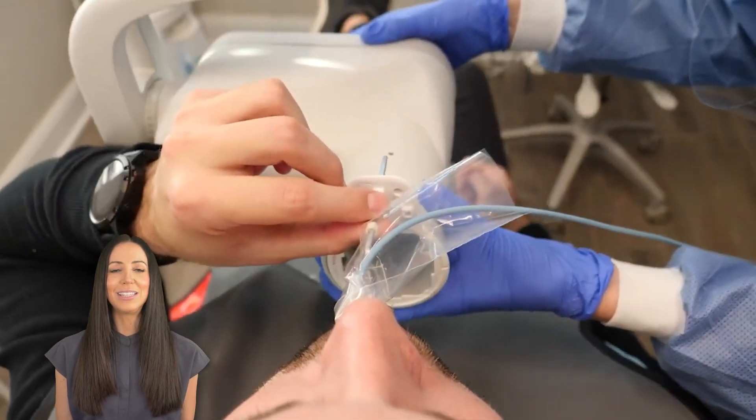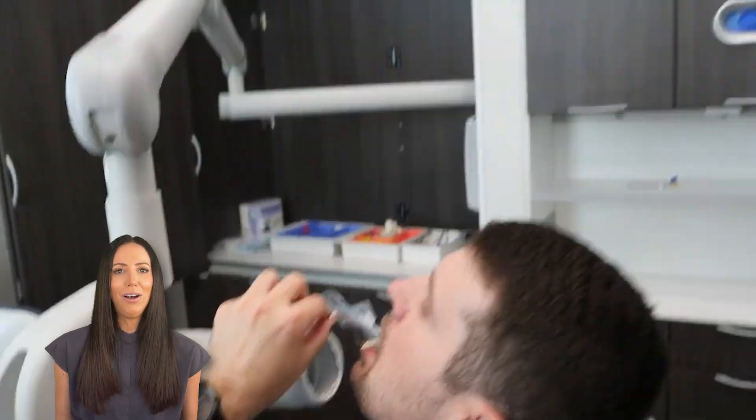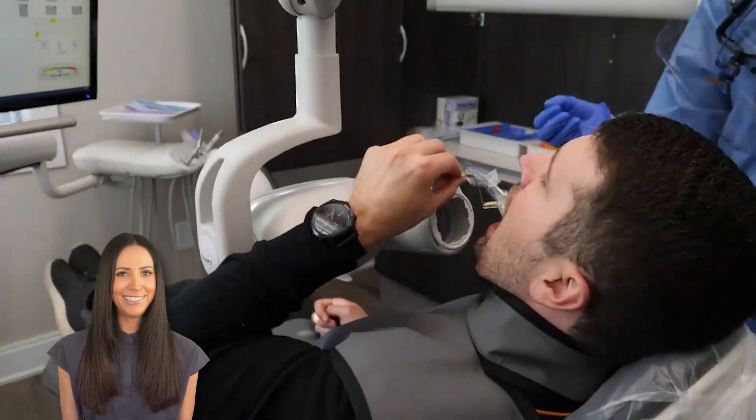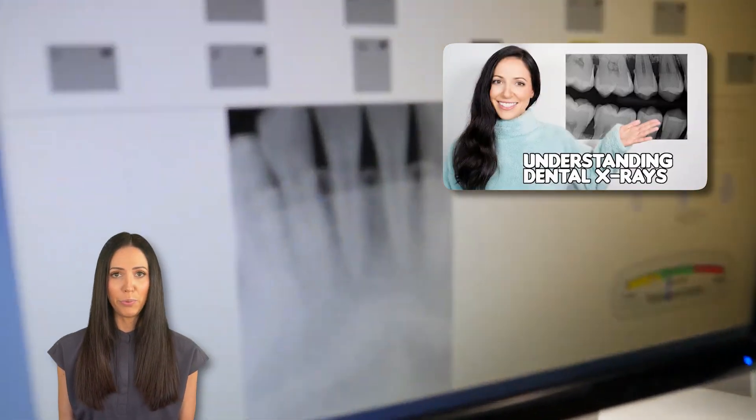To visually see all of your anterior teeth from canine to canine, it is six anterior images in total. The reason why we dental clinicians leave the room each time is because we take these x-rays all day long every day, whereas the patient — you — are only taking checkup x-rays once or twice a year. In this case, the full mouth x-ray is generally only once every three to five years.